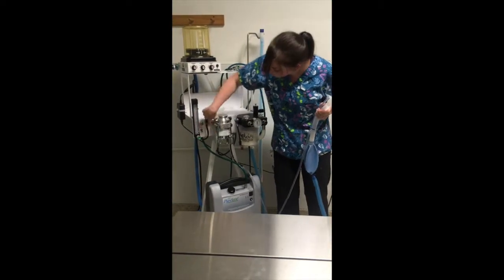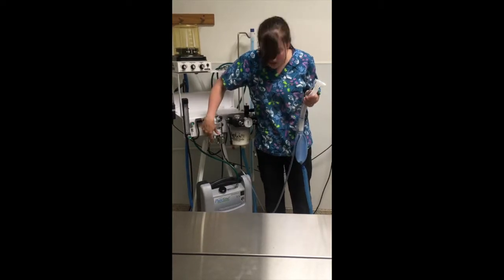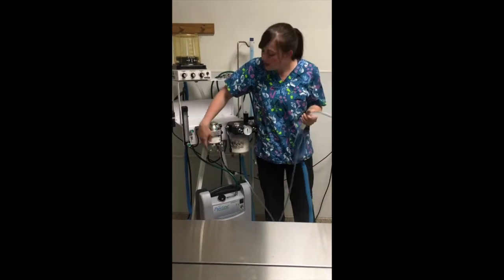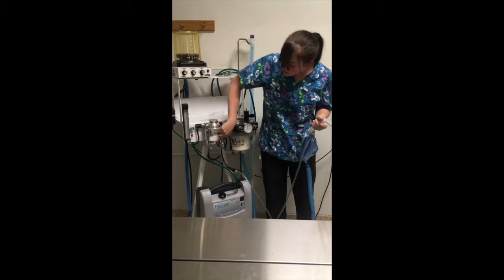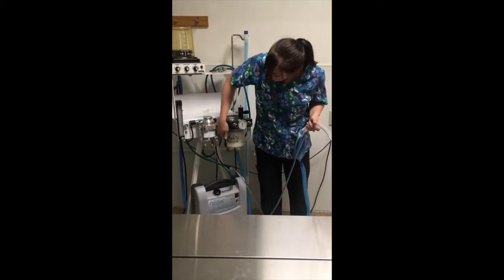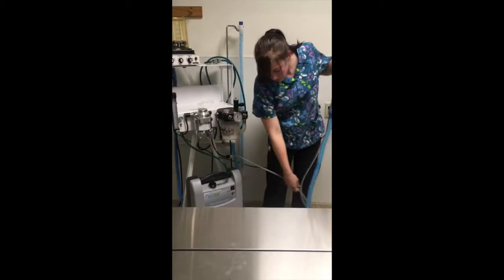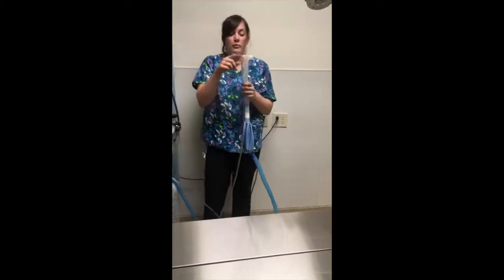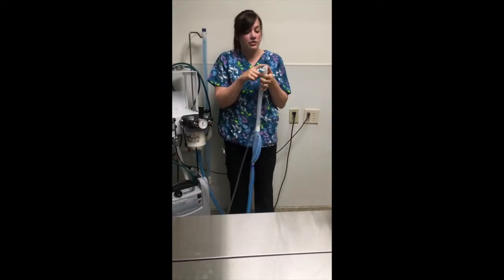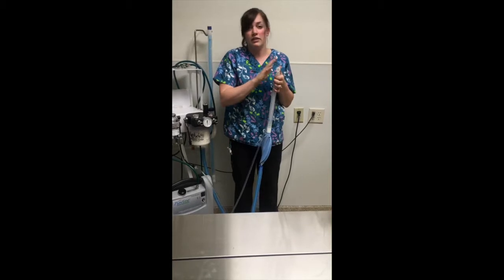So that comes up here to our vaporizer. This vaporizer uses liquid and gases for anesthesia and vaporizes them so they can be inhaled. So the mixture of oxygen and anesthetic gases then travels through our tubing all the way up to the patient. This is going to be delivered at a high flow rate, so it gets pushed directly to the patient.